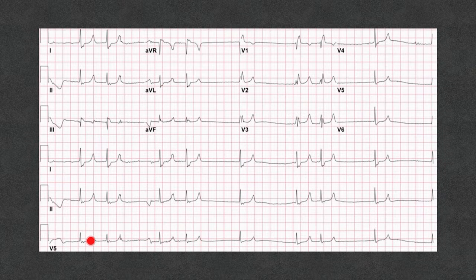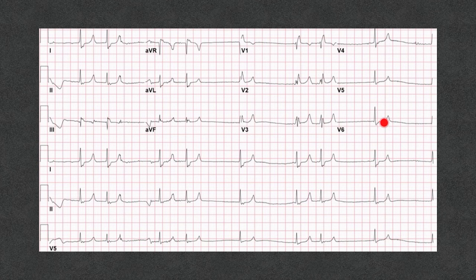This next EKG also shows no recognizable P waves. The QRS remains narrow and there is group beating. You can see sharp peaked T waves — they may not be tall, but compared to the QRS, they are clearly peaked. This is again hyperkalemia until proven otherwise. Initiate treatment immediately; don't wait for the potassium level. The potassium for this patient was 8.2.